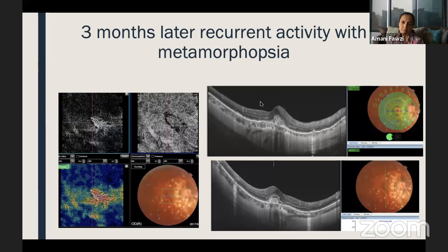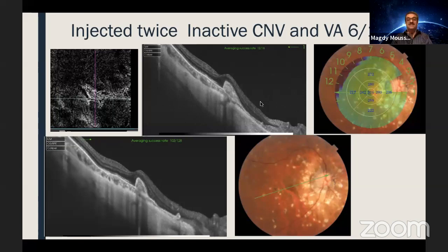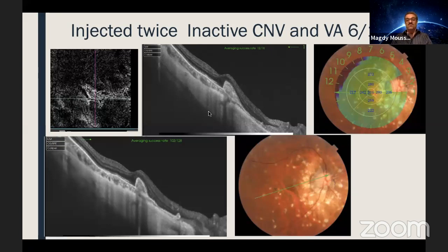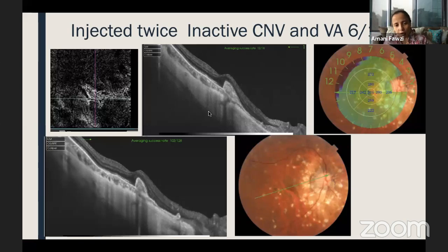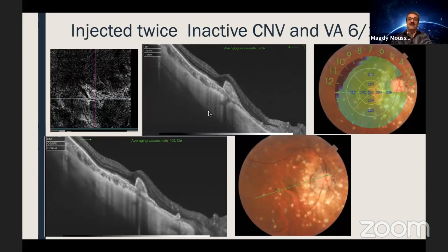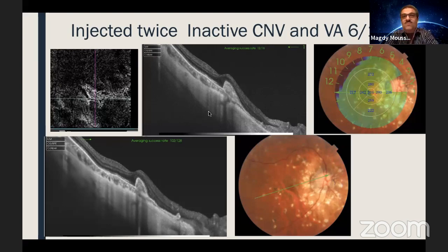I gave injections again twice and she regained 6/12 vision. Look at the OCT — this is like resolved activity with an elevated lesion but no thickening overlying. The foveal contour is regained and OCTA shows very minimal flow in the neovascular complex. The vision of 6/12 is very good and is the maximum vision she is going to achieve. I do OCTA every time because I have it in my clinic, but I count on structural OCT — I never count on structural OCT alone in these cases. I need the vision, the symptoms, and the OCT together to guide management.